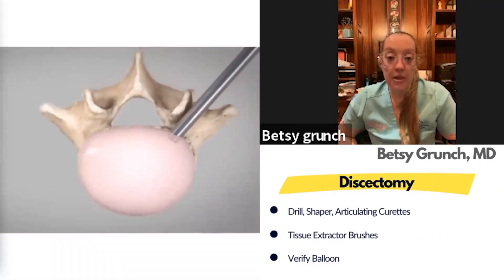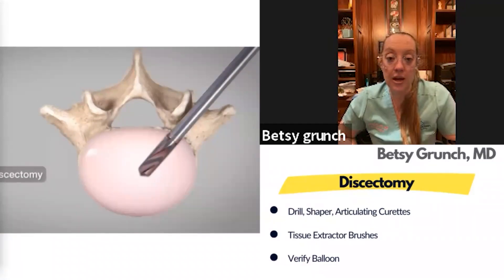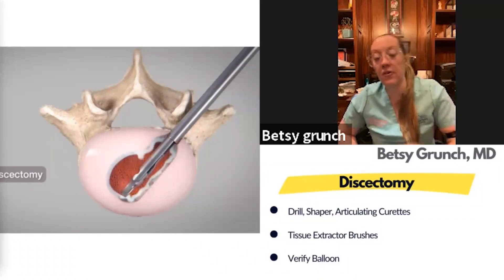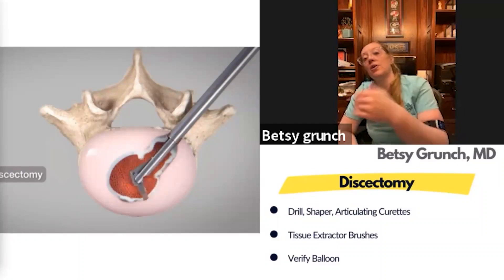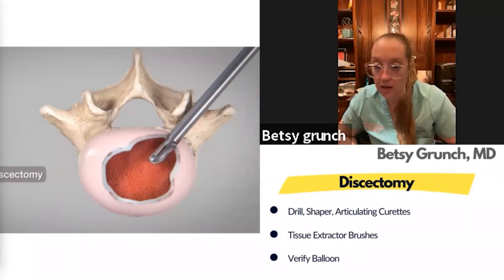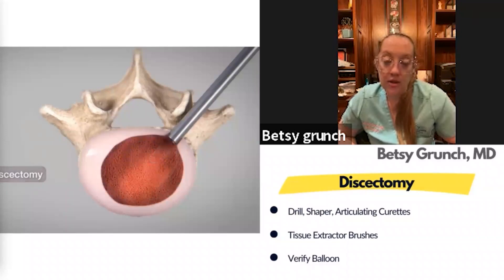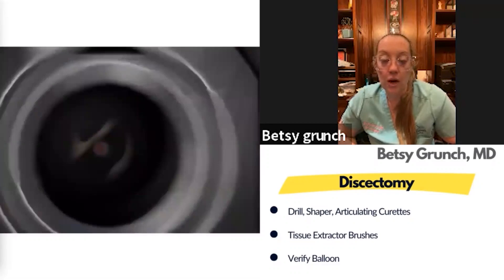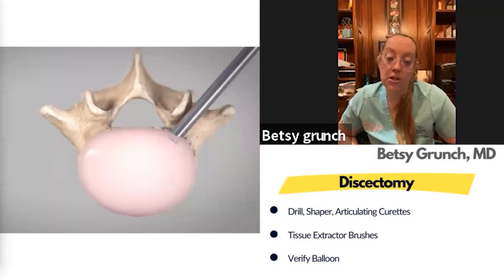Another animation shows the portal in place — the depth drill as the first step for measuring, then the shaper morselizing, then the articulating curettes. You can even wand the portal back and forth to reach even deeper than some of these instruments can. The backwards articulating curette really helps evacuate the proximal part of the disc — an excellent instrument added in the 2.0 set. This demonstrates almost an ALIF-sized discectomy through a seven-millimeter portal.